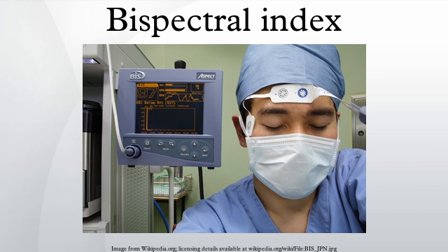The Sociedad de Anestesiología, Reanimación y Terapia del Dolor de Madrid recommends monitoring of anesthetic depth in accordance with literature-based evidence. BIS, however, is not explicitly endorsed. In fact, they cite an American Society of Anesthesiologists statement saying that the decision for cerebral function monitoring should be made on an individual basis.